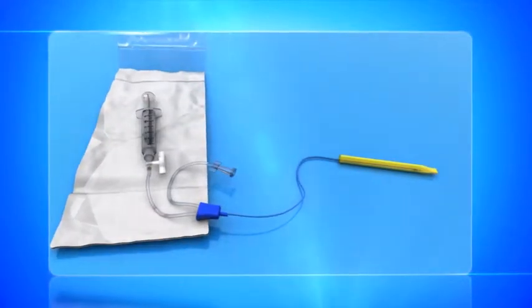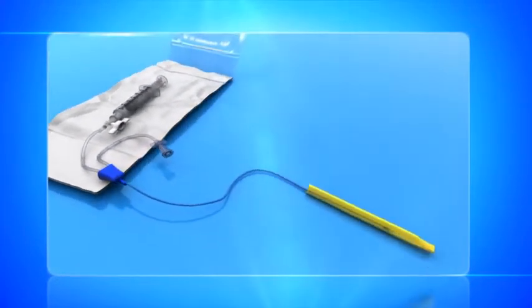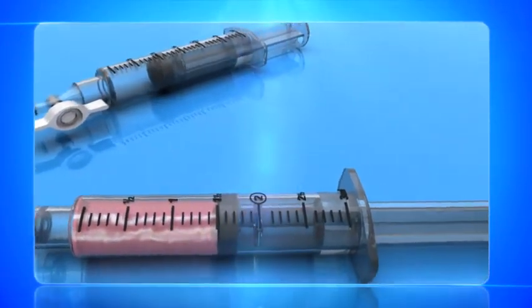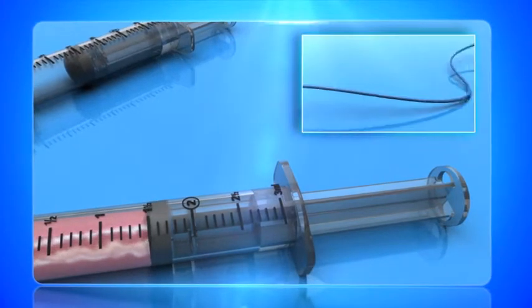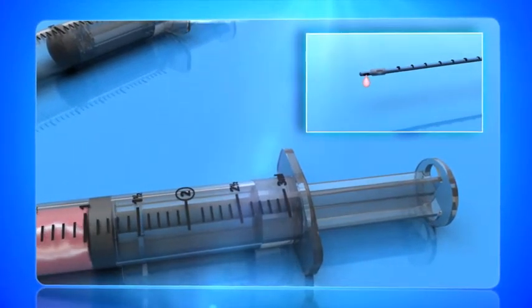Remove the catheter from the sterile package and discard the yellow tip protector. Connect the insemination syringe to the catheter injection line. Prime the catheter by advancing the insemination syringe to the 1 milliliter setting and do not disconnect.